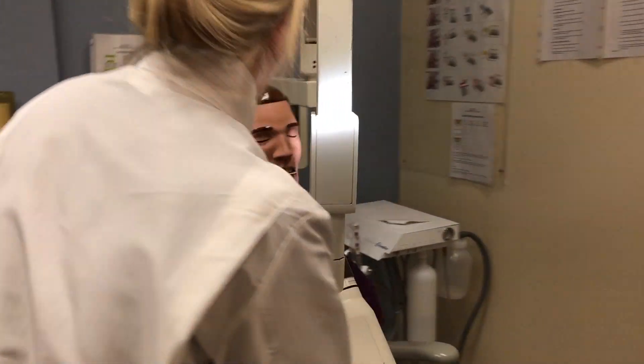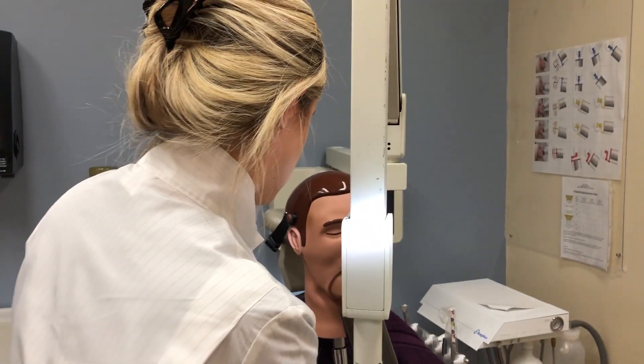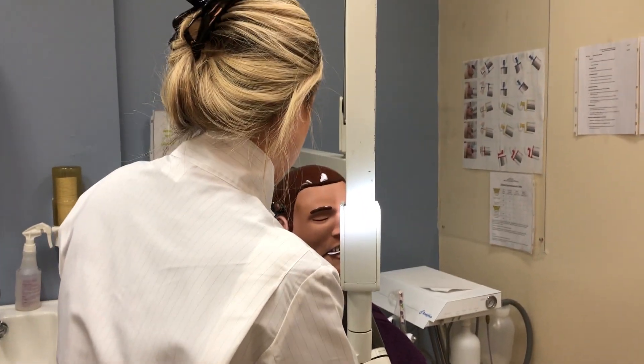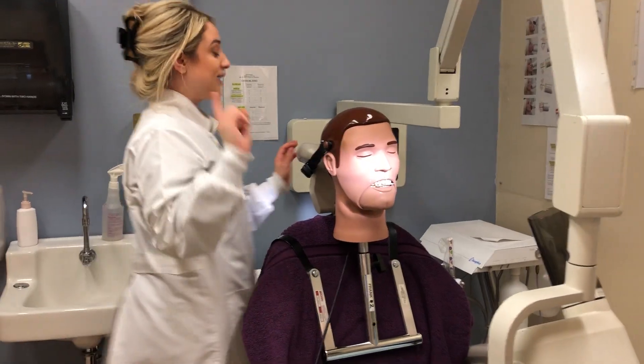We are going to move on to the mandible, and you're going to make sure that the white side is facing the mandible, and you're going to set your vertical angulation to negative 55.